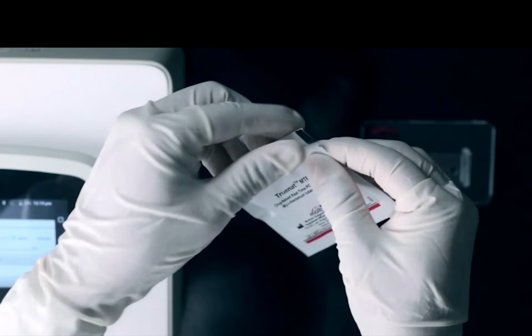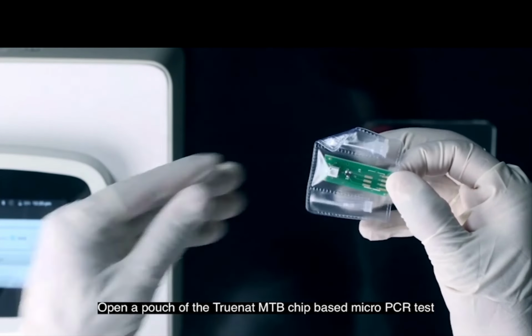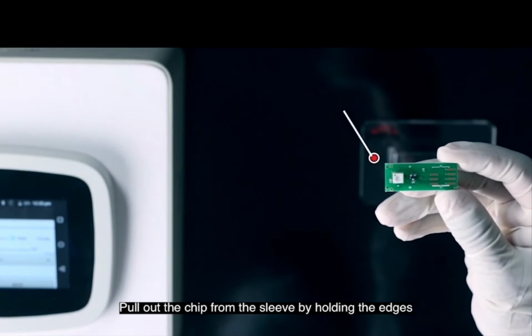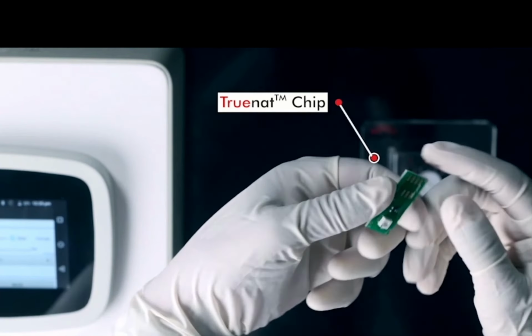So now the chip pouch is there. Inside the chip pouch, you have this chip, which is like a SIM, isn't it? The golden color things are there. So this chip, please only hold it from side to side like they have shown here. You should not touch this golden connector plates, and also that white color well is there. You should not touch any of those areas. Only hold it on the side.